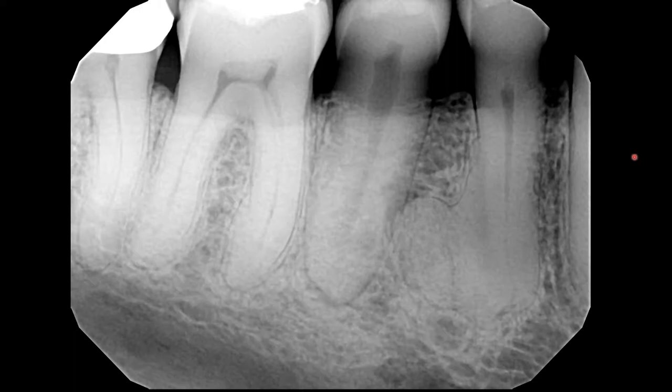On this radiograph, the crowns of the teeth are not completely recorded. It is not necessary to completely record the crowns on a periapical radiograph — it is necessary that you record the periapical region and a few millimeters past the apices. So this is an acceptable diagnostic image.